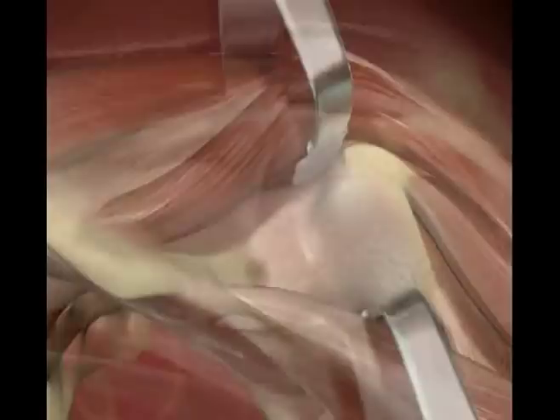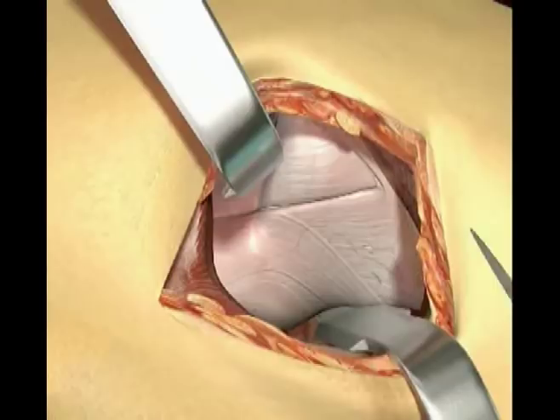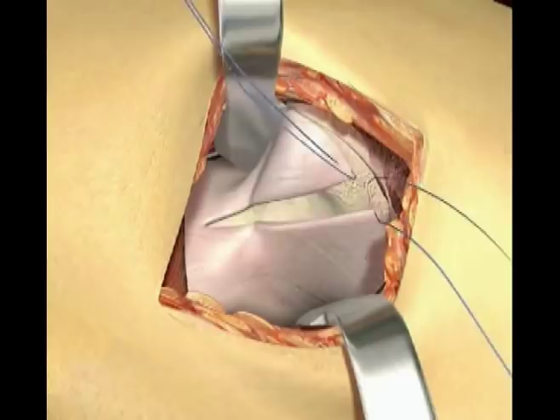Make a T-shaped capsular incision inferior to superior and along the border of the greater trochanter. Lift the capsule away from the bone using a rasp if necessary. Suture and reflect both flaps ready for reattachment. Use a long narrow saw blade to resect the femoral neck in two osteotomy lines along the capsule without luxating the hip.